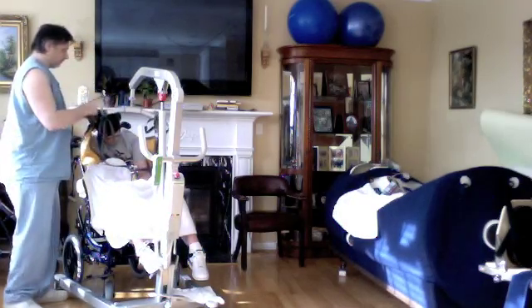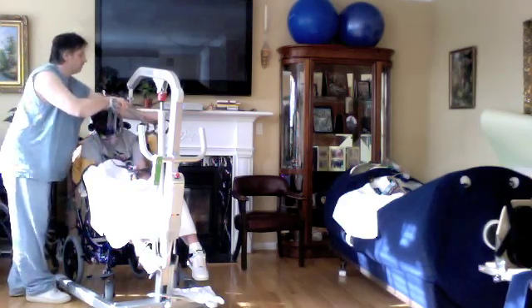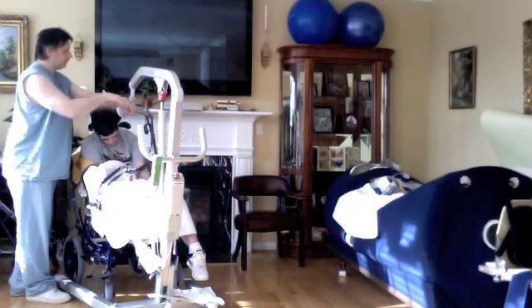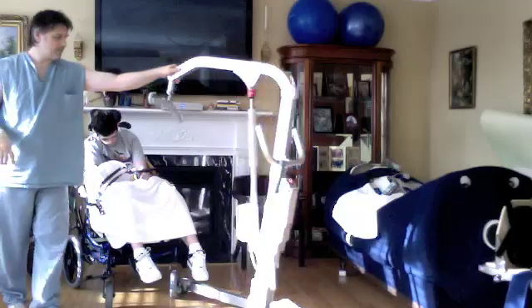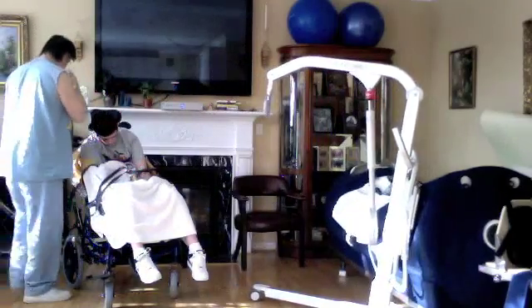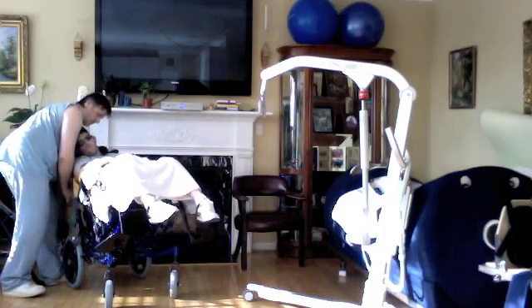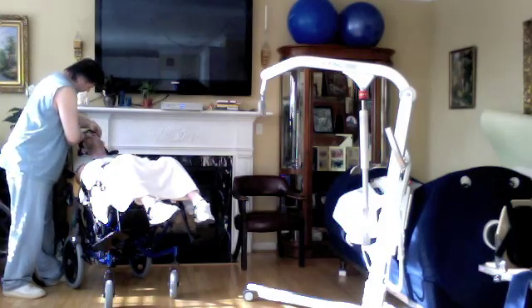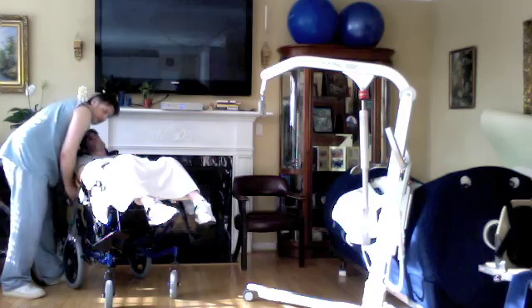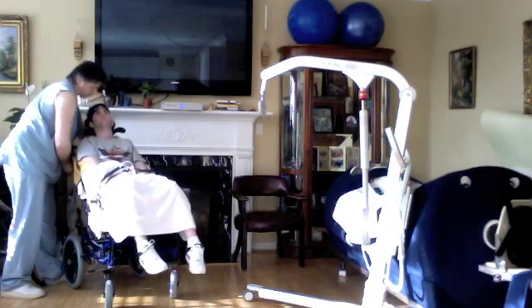And these are the two top points I was talking about. Take those off. Then the two lower that support him around the legs. Slide the sling or the lift out. And I tilt him back so that he goes fully into the chair. Right, Rye? So that's what I do. And then there's a belt I put on it.